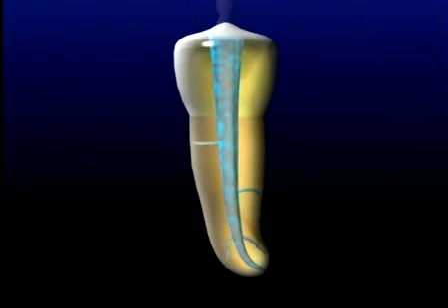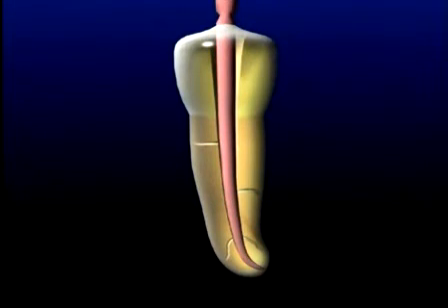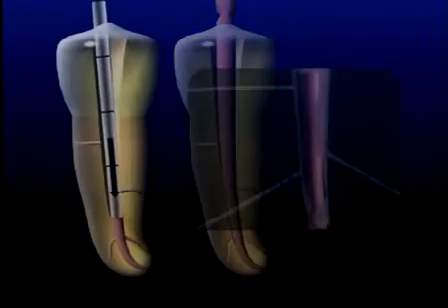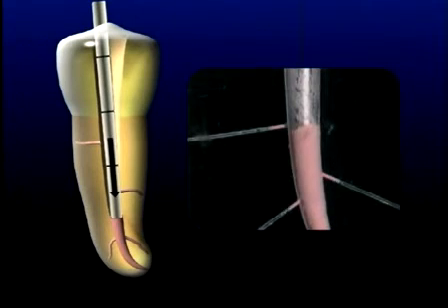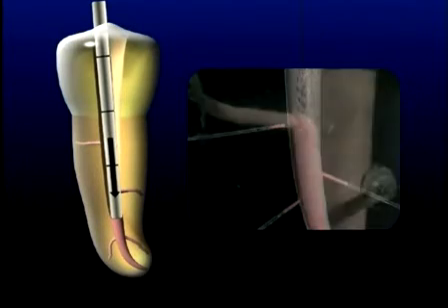Shaping also facilitates packing. Evidence supports a root canal system can be cleaned when we have produced enough shape to fit a fully tapered, non-standardized, fine medium or medium master cone. The idea is to thermally soften the master cone, and utilizing a pre-fit plugger, we can carry a wave of thermal softened gutta percha into all aspects of the root canal system.